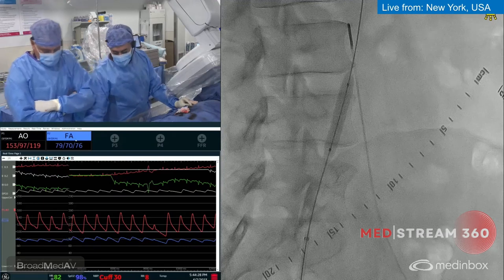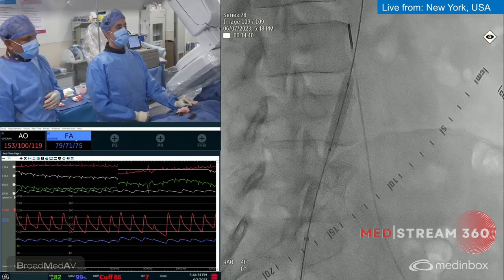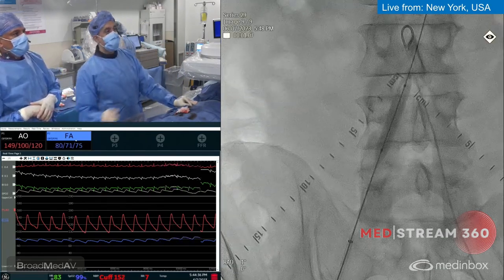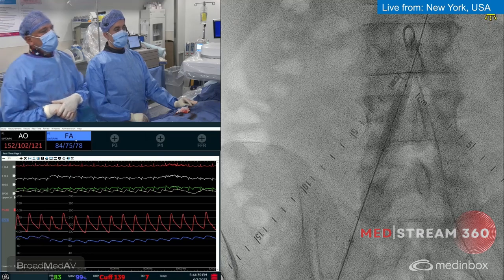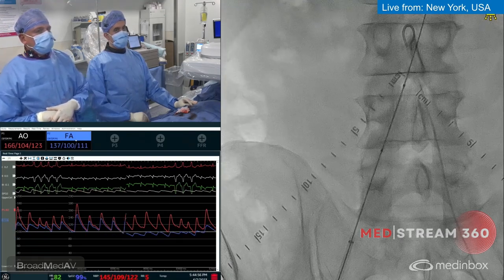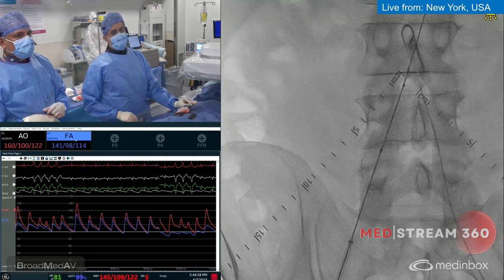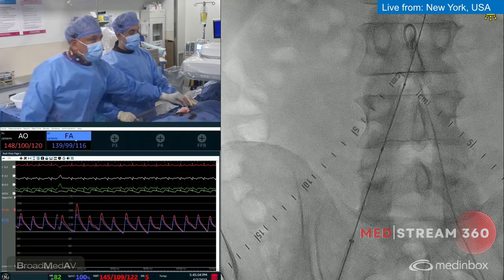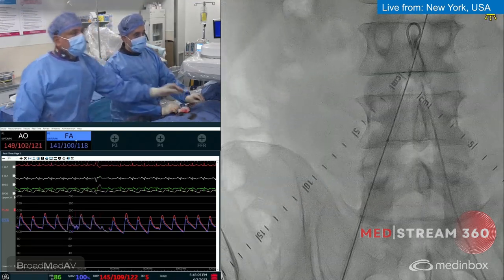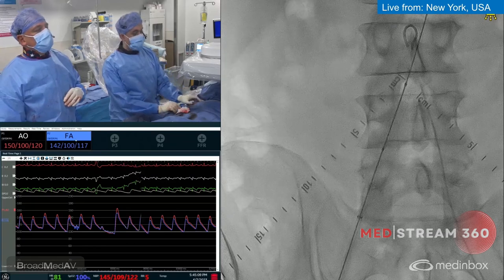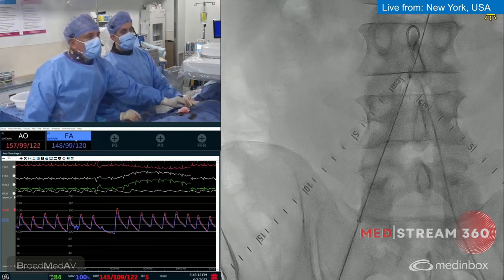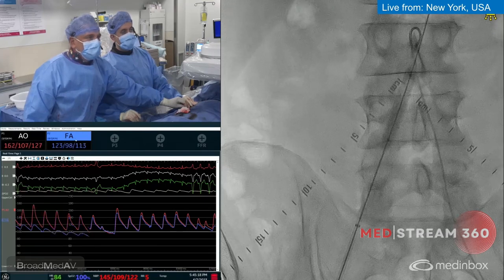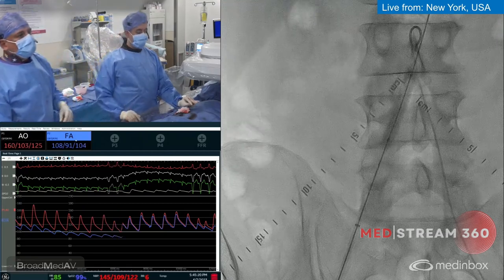Saving the AP view. The pressure is getting pretty close to normal — it looks like we definitely hit the ostium. By the waveforms it's almost equal, one-to-one. Going forward a little bit higher, up to 10 atmospheres just to get the ostium — 6, 8, 10 — then down. We've confirmed we got it. Letting it come down, taking a DSA. Very nice — the lumen is open. Now the question is what to do with the self-expanding stent distally.